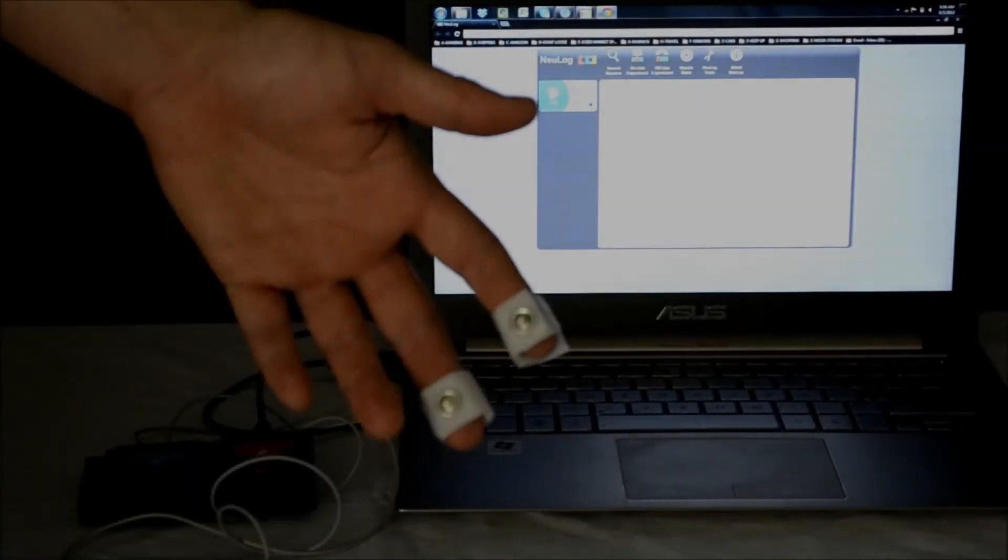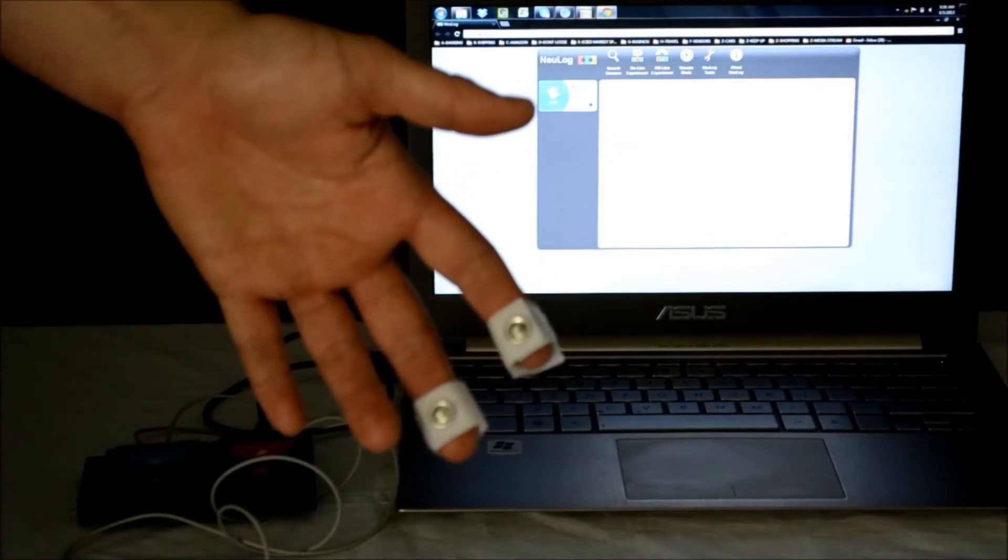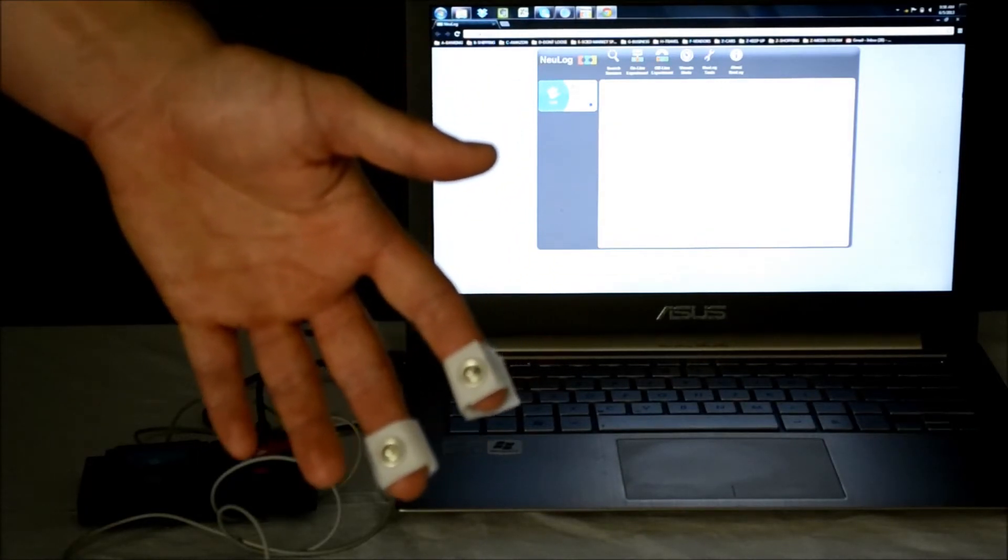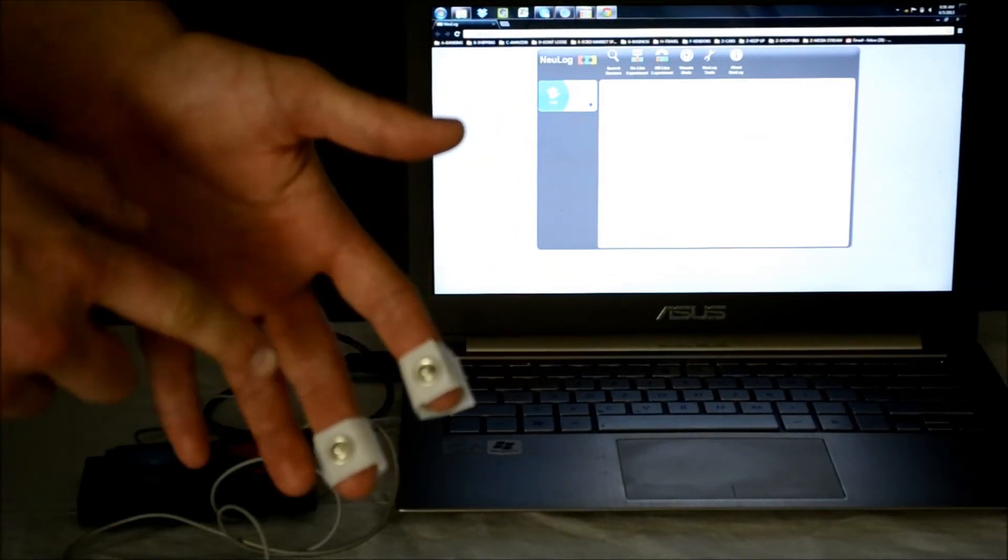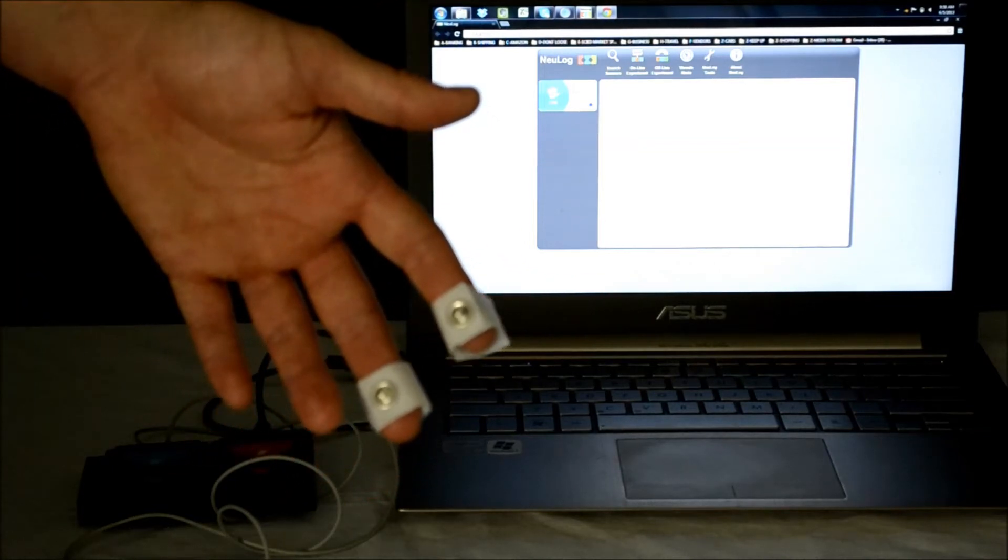The sensor comes with these two velcro straps which connect to your fingertips. On the inside of the strap is a small metal plate that is very sensitive to electrical conductivity.